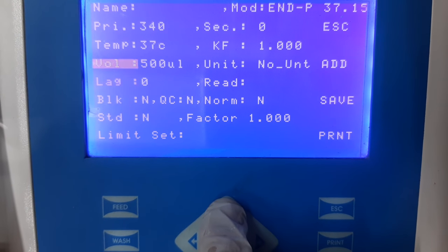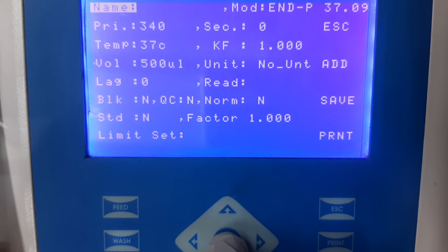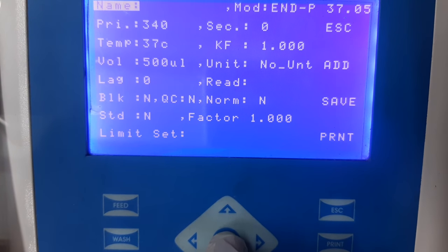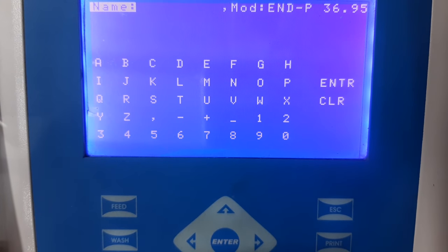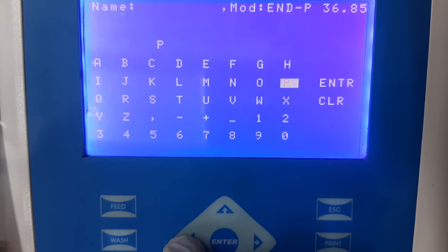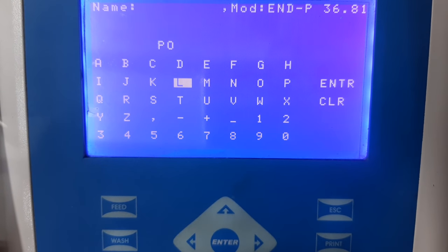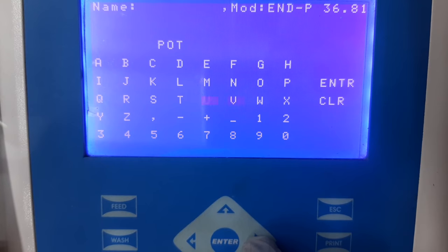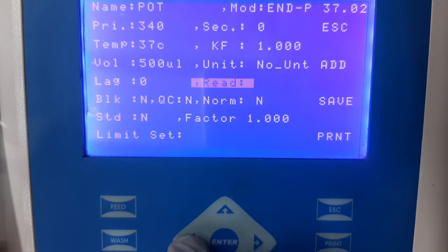As you can see, there are multiple fields that need to be filled in. The first information that needs to be added is the name of the test. You can add any name which is suitable according to your laboratory settings. In this video, we are adding POT as the name of the test. Once you have added the name, press enter and come back to the home screen.